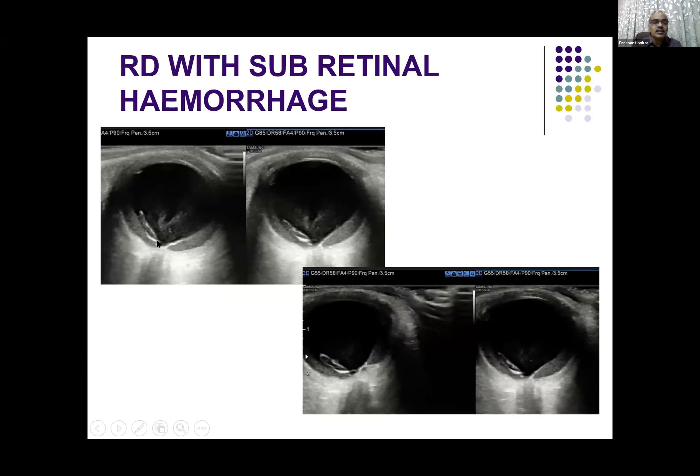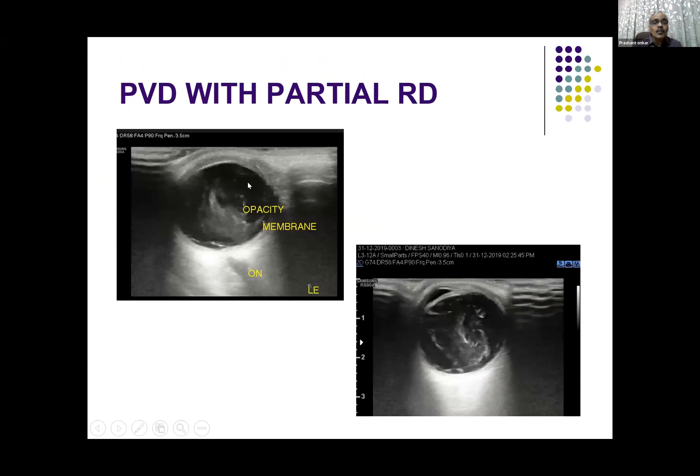In this case, there is vitreous detachment and a small tractional retinal detachment has occurred. That can pull the retina, as I have said, and you can see that partial retinal detachment is quite common.